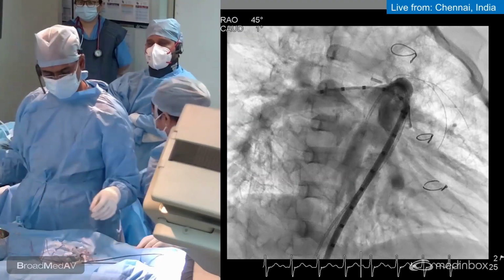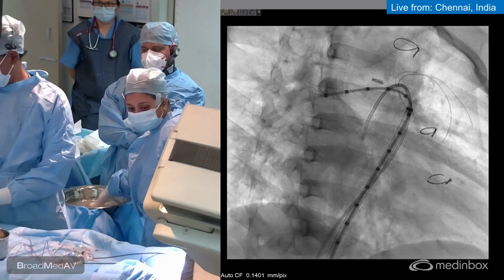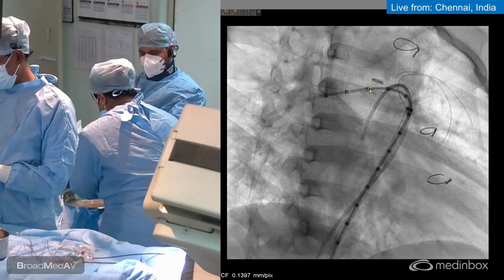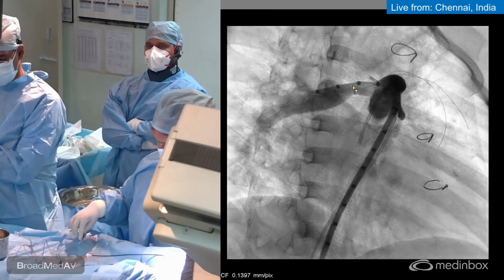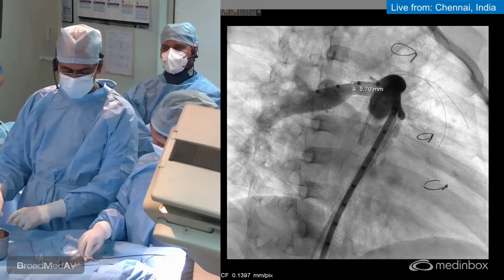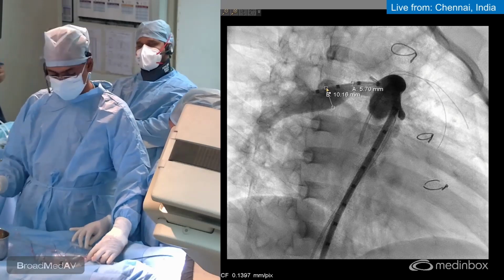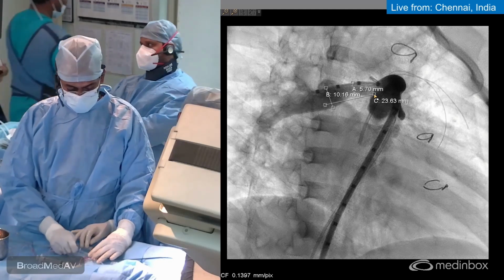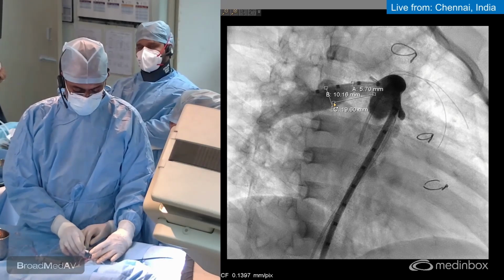If we come back to the question again, sir. Like what are the qualities of the stent which would be suitable for a branch PA? Now, one of the most important characteristics for pulmonary artery stenting is that since we are doing it at just 4 years of age, it should allow re-expansion of the stent to a larger diameter when the child is growing and the somatic body growth increases. So for that, we need to be sure that the stents are post dilatable.